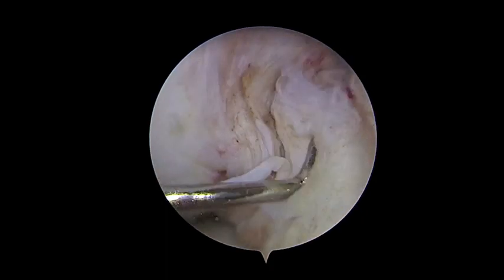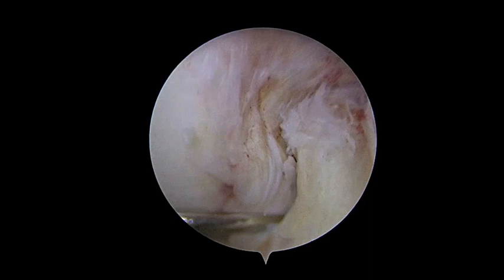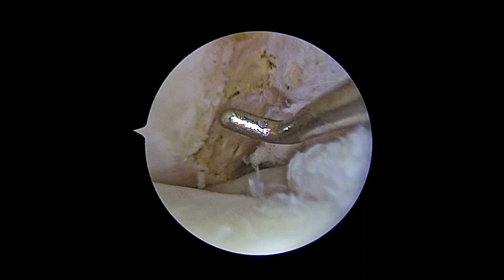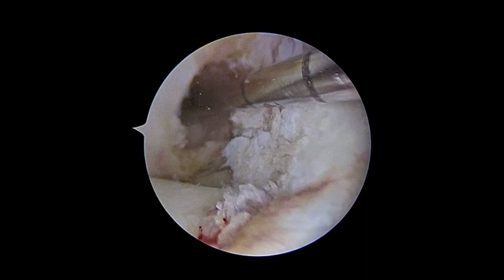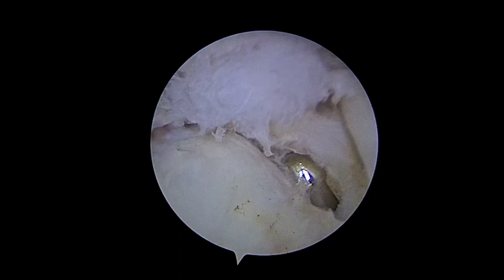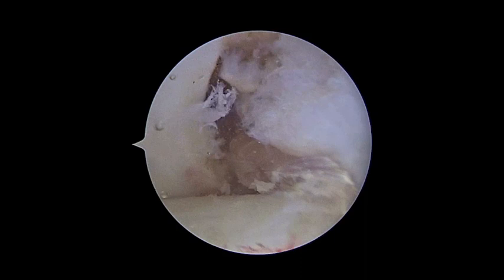This is an ACL proximal rupture in a young patient with an excellent stump. We decide to do a posterolateral ACL augmentation. We clean the center of the posterolateral bundle and we made a hole of eight millimeters in the femur and nine millimeters in the tibia. As you see, behind the ACL stump, we pass the graft from the tibia.